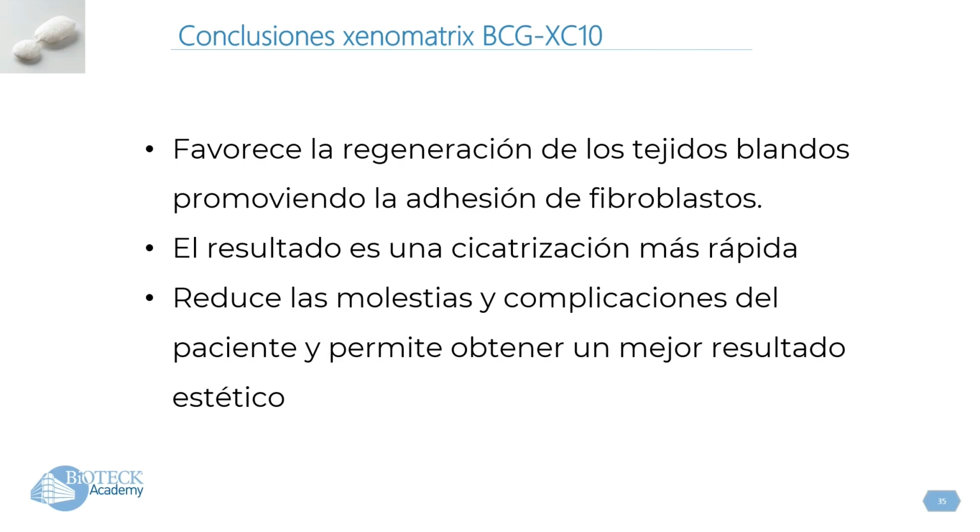And this is due to the fact that it avoids opening flaps, which can result in more discomfort for the patient, and is also more difficult for the surgeons to operate.